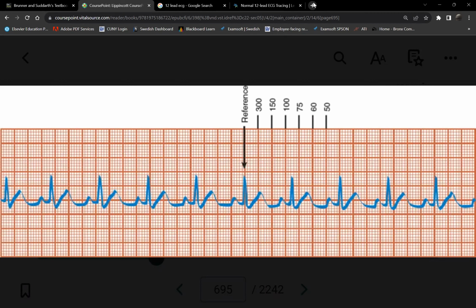Okay. So don't worry, because this is again an estimate. Nothing is accurate here, because is this ever going to be accurate? No, because this is only 6 seconds. I need an entire 60 seconds for it to be accurate. Are we clear? Alright, so that's one method.